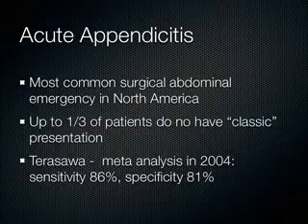Now, CT clearly has the best characteristics here, but doing a CT scan is about 500 chest x-rays worth of radiation, and when you're young in life, your tissue is more radiosensitive, and you have a longer time in which to absorb radiation throughout your life, and radiation exposure to put you at risk for cancer is a cumulative effect, so we try to avoid unnecessary CT use, especially in patients less than 35 years old. And certainly when I have a kid in my ER, 10, 12, 14 years old, I really try to avoid getting a CAT scan on them, though sometimes I have to get it because the benefit outweighs the risk.